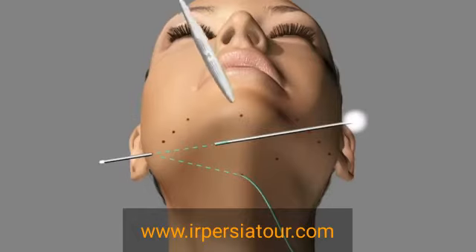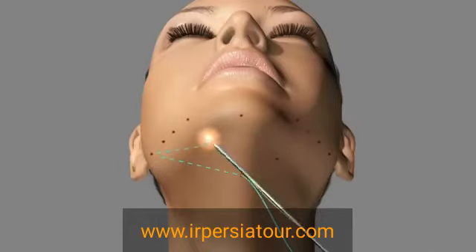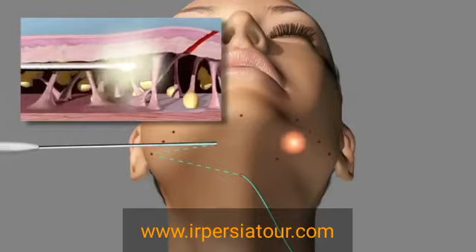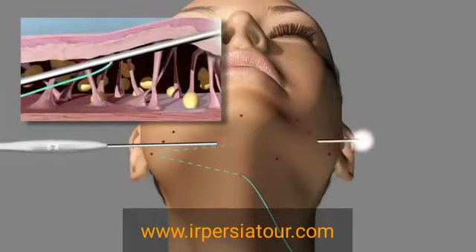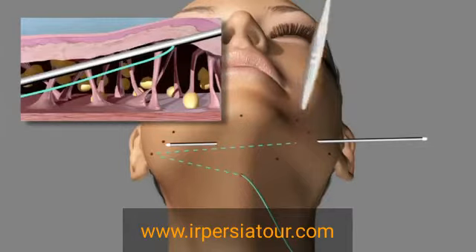The suture matrix is weaved in a crisscross fashion, going to every other mark as the suture is advanced anteriorly towards the submentum. Eventually the suture will be brought out through the submental stab incision where the liposuction access was obtained as well as tunneling access.